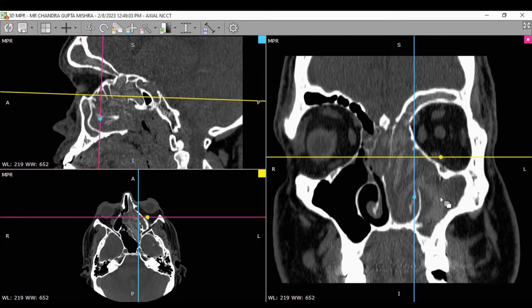And we have done a type 2 MMA. So will there be a difficulty in the postoperative drainage? Not really. Still it will drain towards the area we widened, the ostium. Still it will drain there. It is not the gravitational drainage which is important.